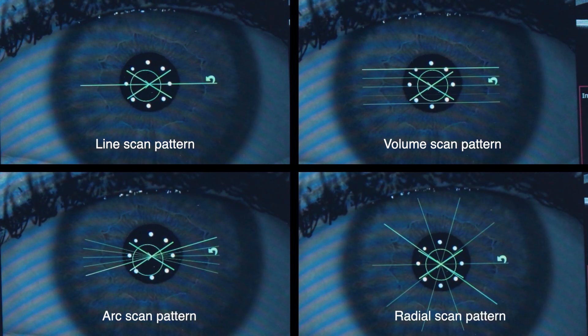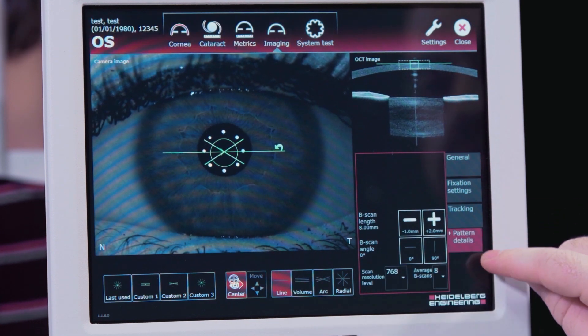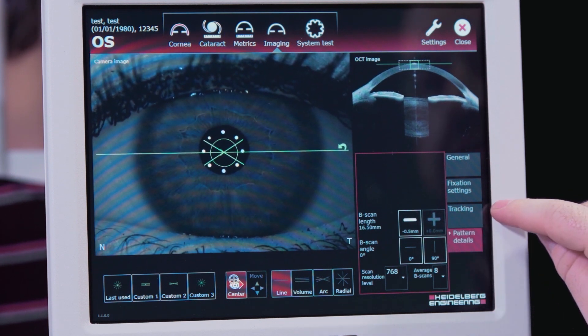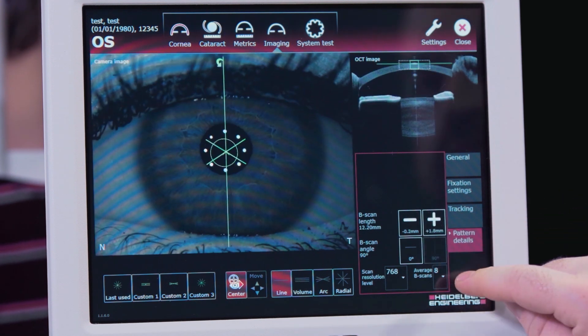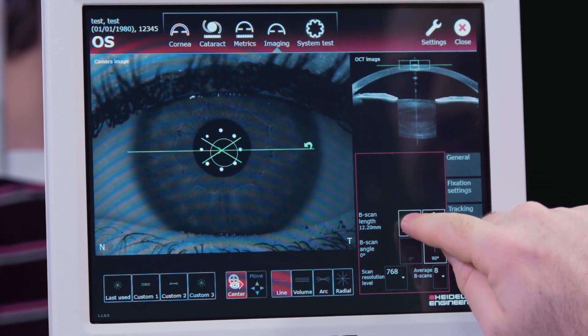We can adjust all the scan patterns on the imaging app with the pattern details tab. We can change the length, the angle, or we can manually adjust the orientation by dragging the scan on the camera image window.